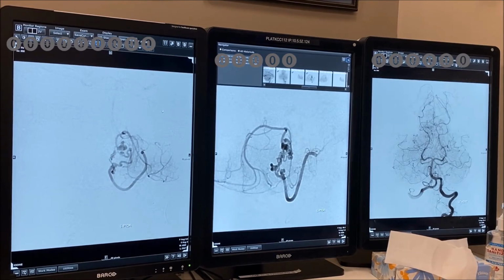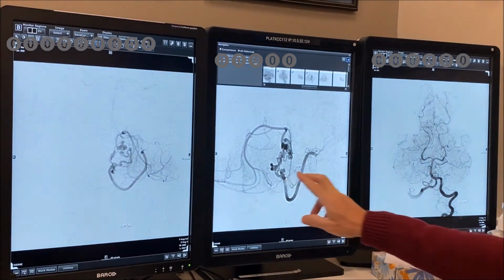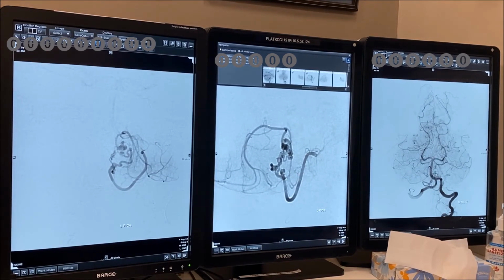Have you guys seen or know about the PICA anastomosis? The PICA anastomosis is at the tonsillar segment. The PICA, as you see in this AP view, this thing comes here. The other PICA would come here. So the side-to-side anastomosis is done in the midline from the tonsillar segment. Unfortunately, the lesion here is distal to it. So the only way to do a bypass would be into this branch, which now is more difficult, and you've got to transpose all that. So it's problematic. So now I could go surgically clip here. Not good. Not good. So I need to do some more workup.